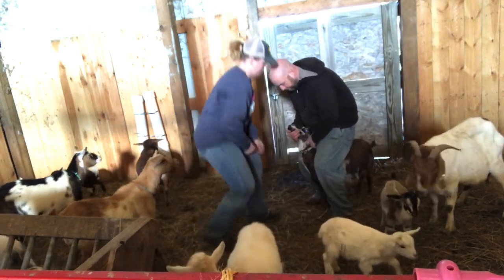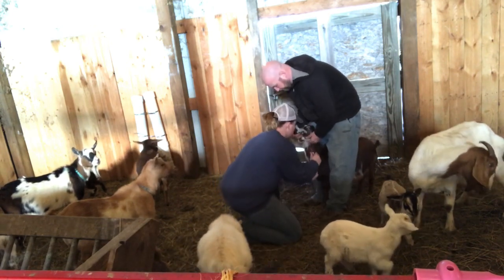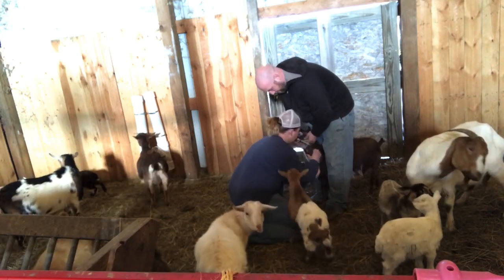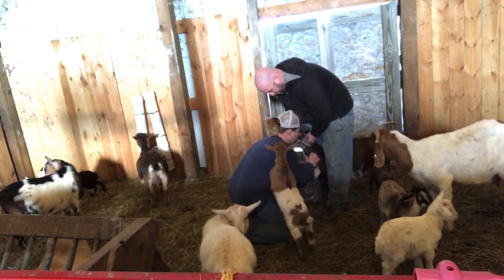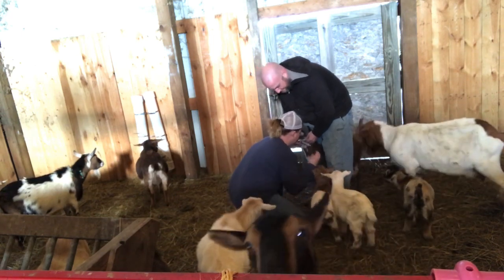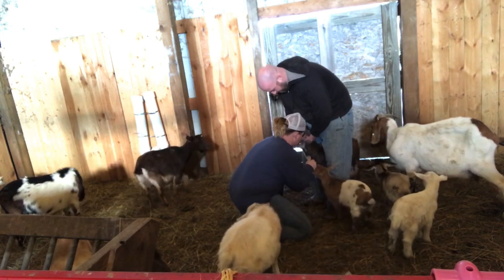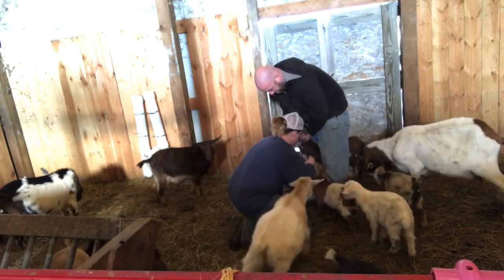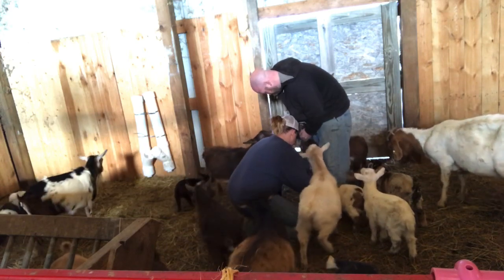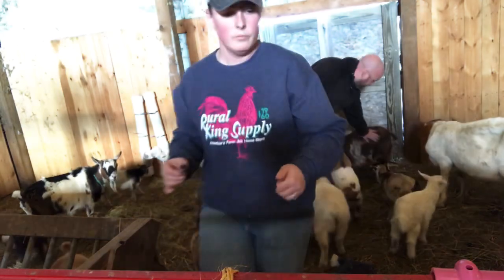Mark has the doe between his legs. I'm putting pressure down at the bottom near her breastbone while Mark holds her head up and turns it slightly to the side so that I can find her jugular vein. What I'm doing with my thumb is trying to figure out where that jugular vein runs — it balloons up nice while I'm holding the pressure. I'm inserting the needle upwards and slowly drawing blood out, trying to make sure to hit the vein but not go through. The other goats did not make that easy — we're being molested the whole time.